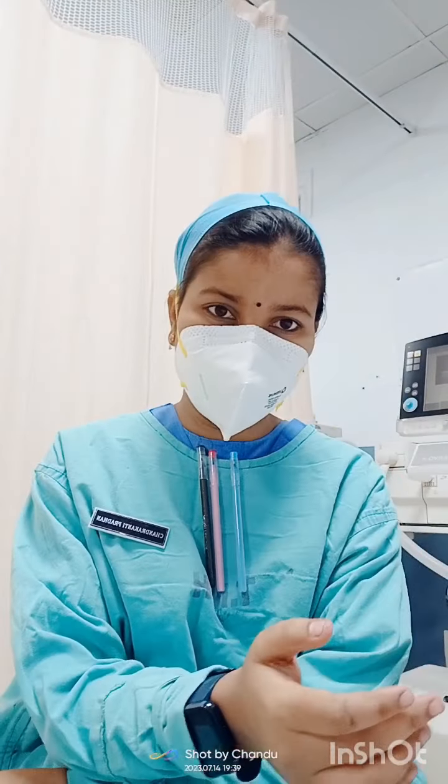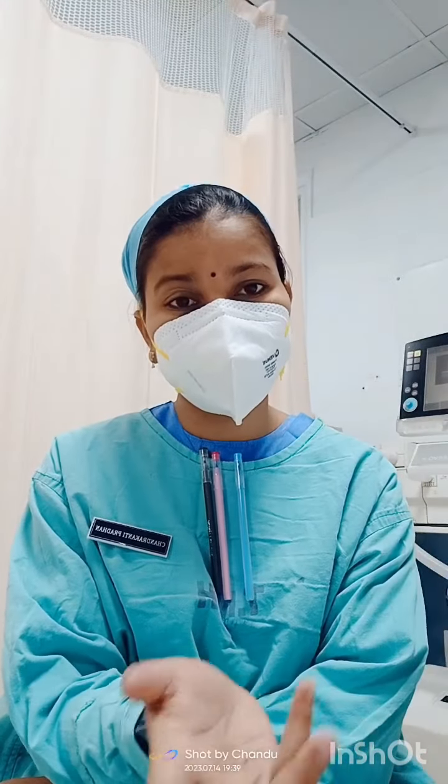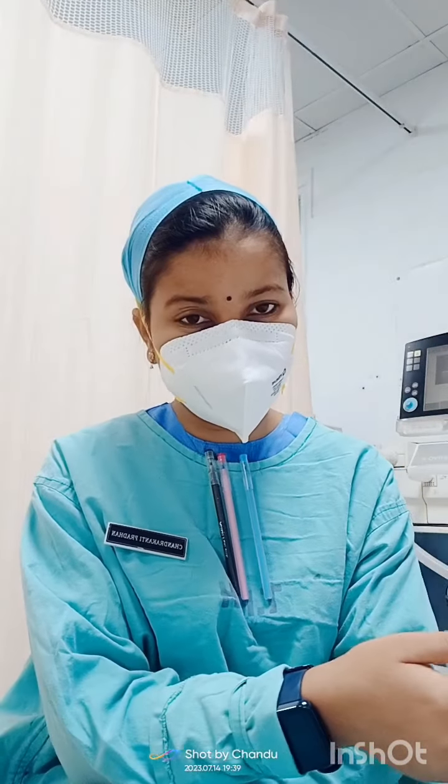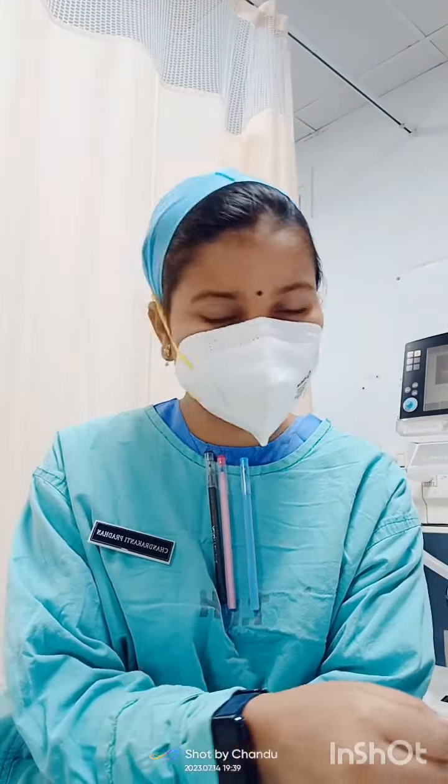In a monophasic defibrillator we use 360 joule energy for pulseless VT and VF, or in a biphasic defibrillator we use 200 joule energy to provide defibrillation to the patient. So next comes cardioversion.